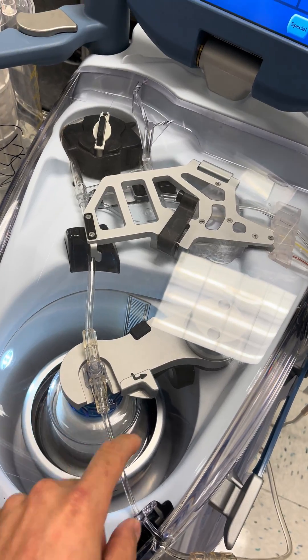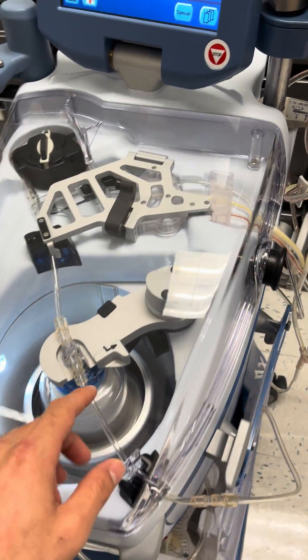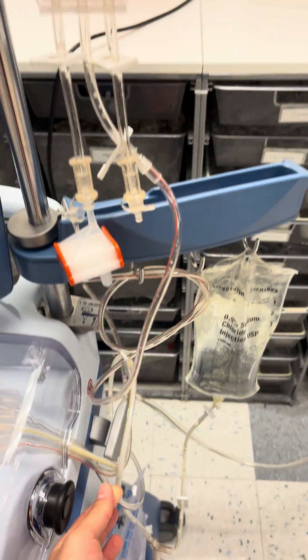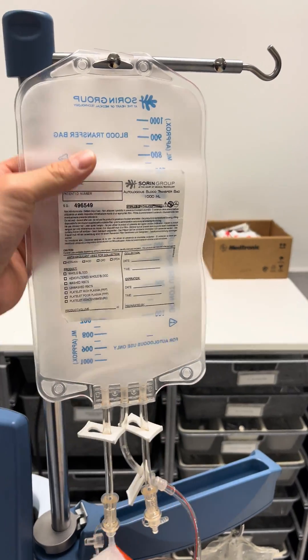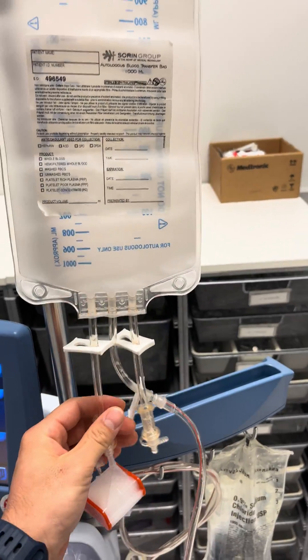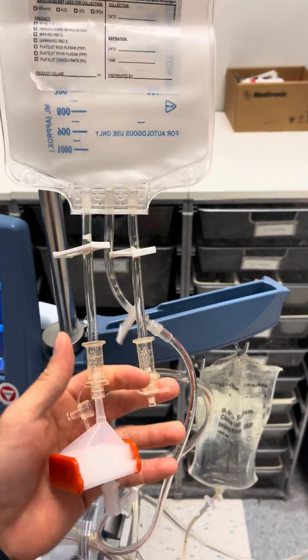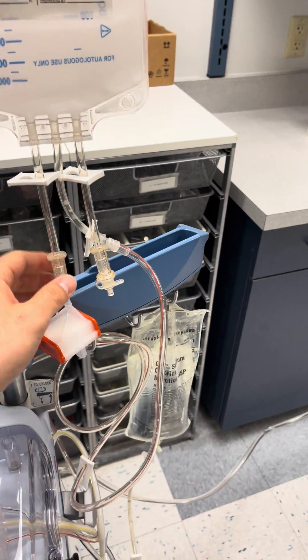Once the blood in the bowl has been cleaned — spun and washed — it exits through the red line, which goes into the reinfusion bag. This is going to contain packed red blood cells with very high hematocrit. Oftentimes you'll attach a filter to one of the ports, and then connect that to an IV line or a central line — that's how you transfuse the blood back to the patient.